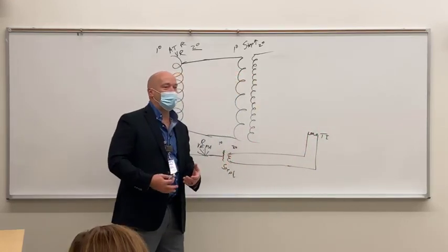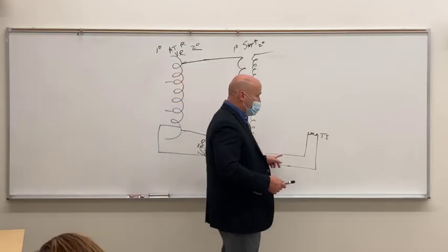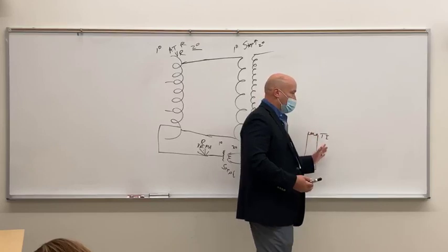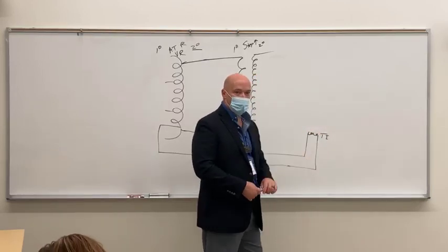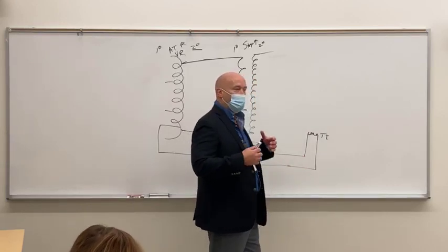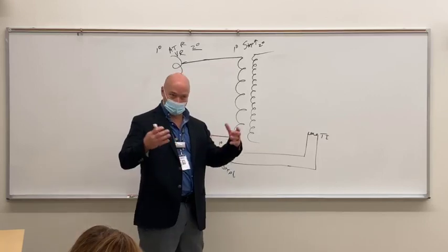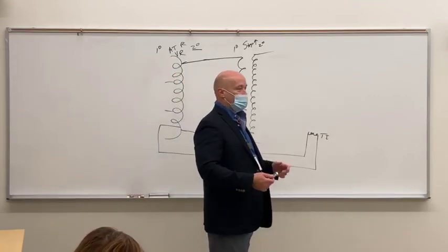It's not hot enough to do any kind of damage, but it keeps it a little bit warm, because if we put a big exposure on that filament, or a lot of thermionic emissions on that filament, and the filament's cold, it's kind of like throwing hot water on your windshield in the wintertime to get the frost off. What's going to happen? You're going to crack it, right?